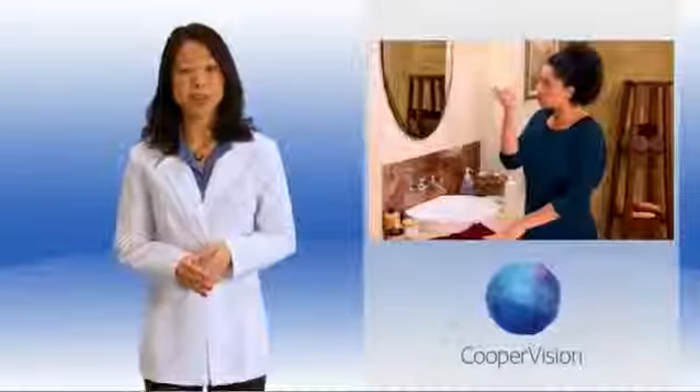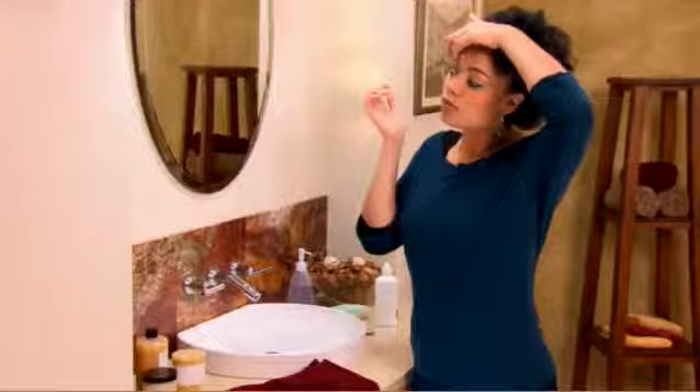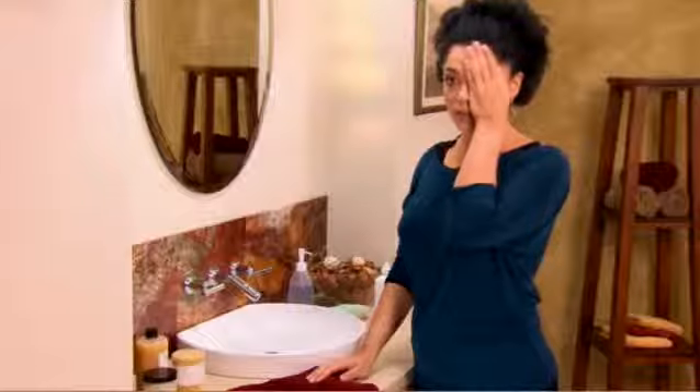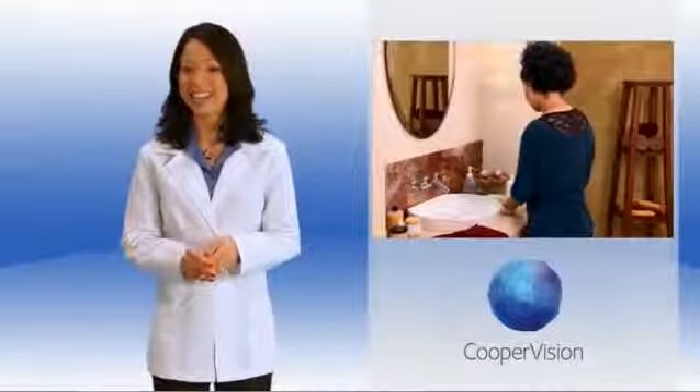Next, pull down your bottom eyelid using the middle finger of your right hand. Use the index finger on your left hand to hold up the upper eyelid and the eyelashes to avoid blinking. Now look up so that the white part of your eye is visible. Gently place the lens onto the white part of your eye without pressing it in. Let go of your bottom eyelid first, look down to help position the lens, then release your upper eyelid. Close your eyes and blink several times to ensure the lens is in place and centered. Once the lens has been applied properly, cover your left eye with your hand and view an object in the distance to ensure the lens is in place and that you can see correctly.